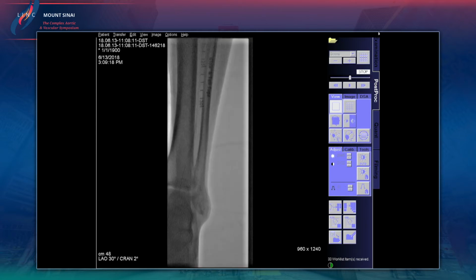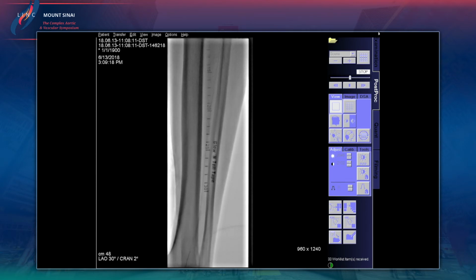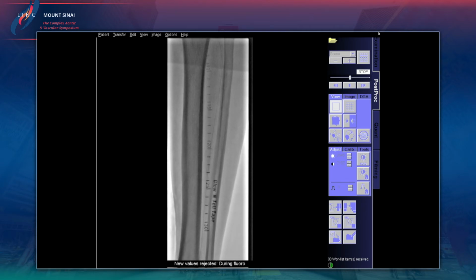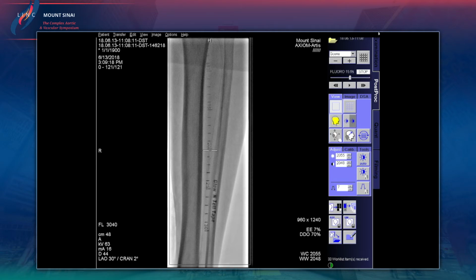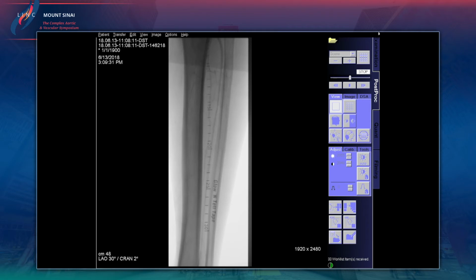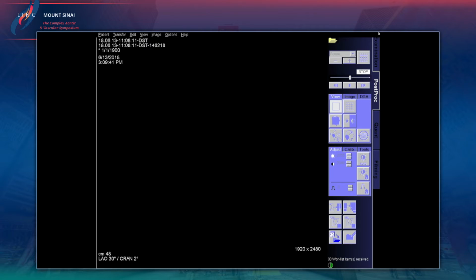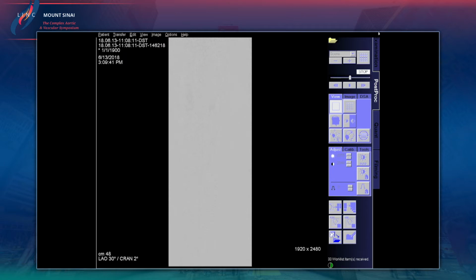I hear what you're saying about the wire sometimes gliding through these, but I haven't personally experienced that. I've not had a patient I've treated with a DCB that then acutely presented with a thrombosis or clinically looked like a thrombosis. They tend to be restenosis down the road. And if it was a true thrombosis, then that implies you're lysing them or using thrombectomy at the time of the procedure. Has that been the case for those?